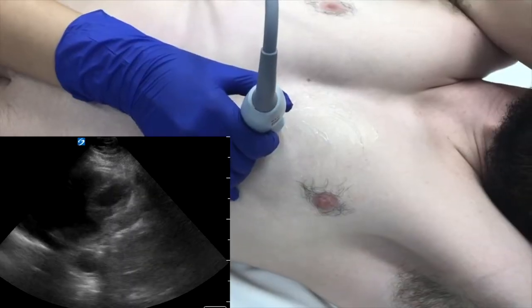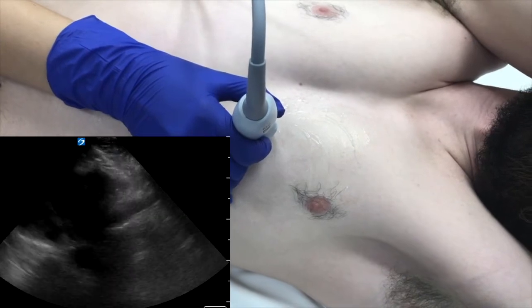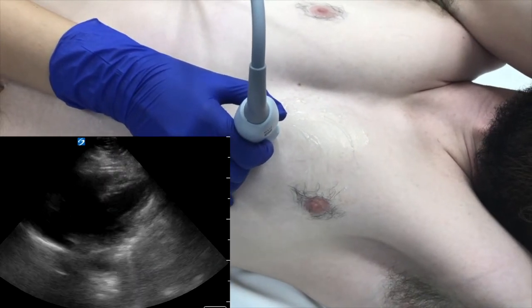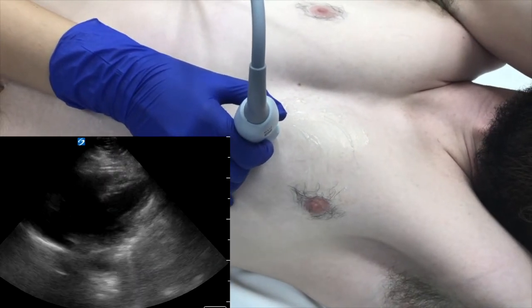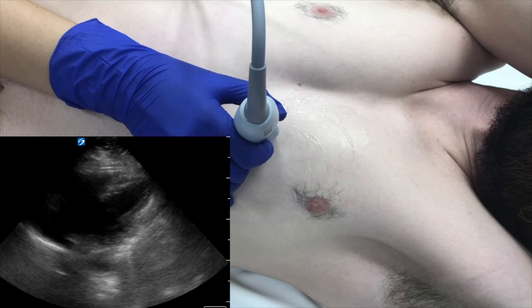A second window that can provide a more complete view of the heart is the left parasternal view. The probe is positioned just lateral to the left border of the sternum at or below the level of the nipple. It should be oriented in a slight oblique angle with the probe marker pointing toward the right shoulder.